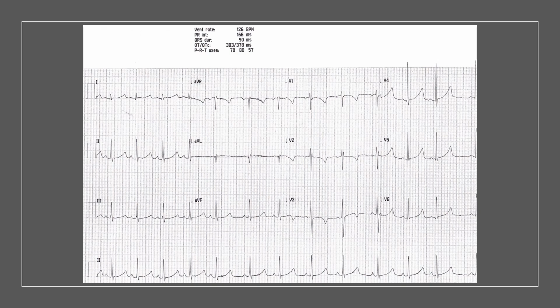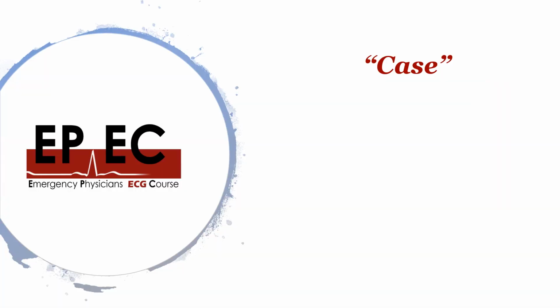And if we add on top of this that it is a pediatric ECG, which is something that we don't do that often compared to the adult ECG, then definitely many of us will feel very uncomfortable interpreting pediatric ECGs. So why don't we leave this case as it is at the moment, and let's move on to the adult side. Let's talk about a different case.